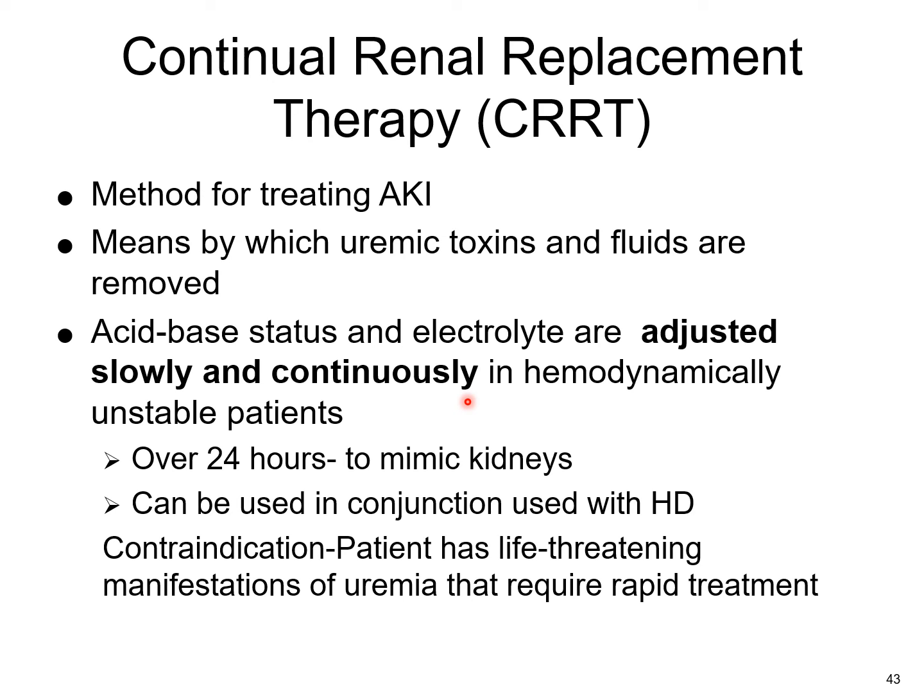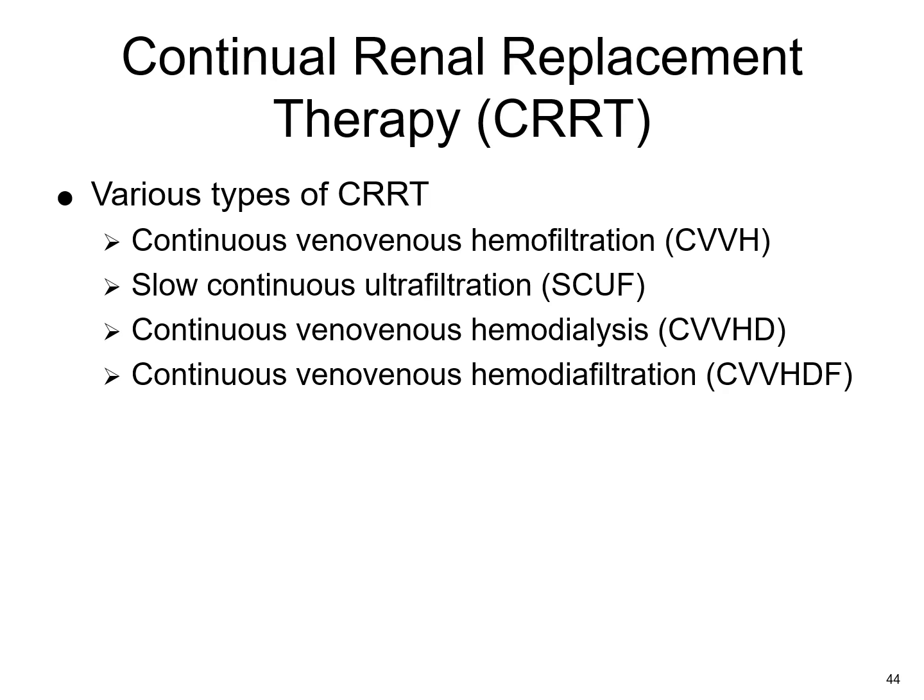So you're trying to do this type of treatment to kind of mimic what the kidneys normally do in a 24-hour period. You can do your CRRT in conjunction with hemodialysis if needed, but for the most part, we're not doing CRRT if the patient has any life-threatening manifestations that require rapid treatment. Just know that there are different types of CRRTs out there depending on how the patient is presenting and what they need.